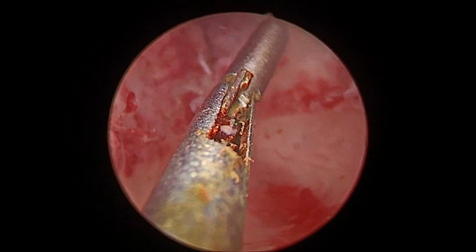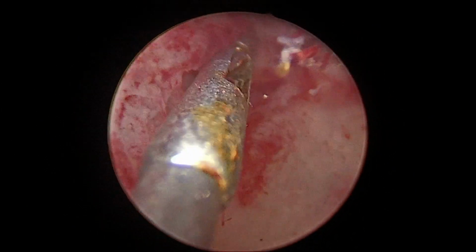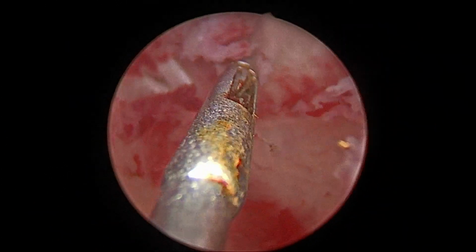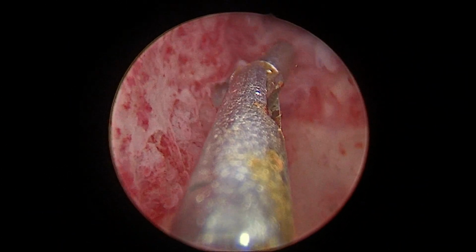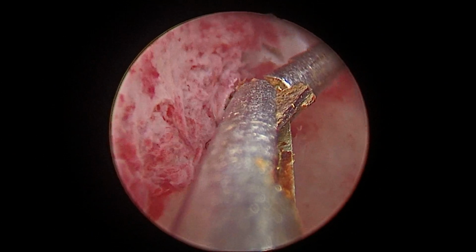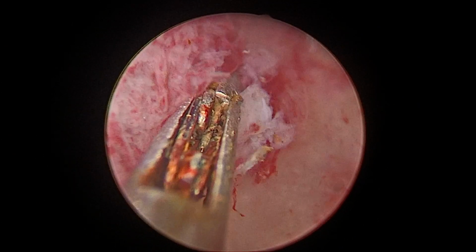We used the grasper once again and with repeated attempts was able to remove the piece of thread of the copper T.